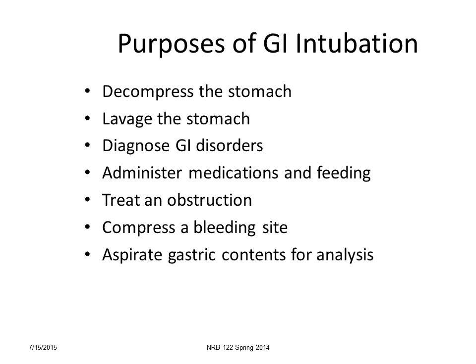Typically, what you're going to be doing as a student, though, is using the GI tube, either a Levine tube, a nasogastric tube, or a gastrostomy tube to administer medications and feedings. And we're going to get into a little more depth about that. For certain disease states, you may also use a tube to treat an obstruction. And sometimes they actually use a tube to compress a bleeding site.